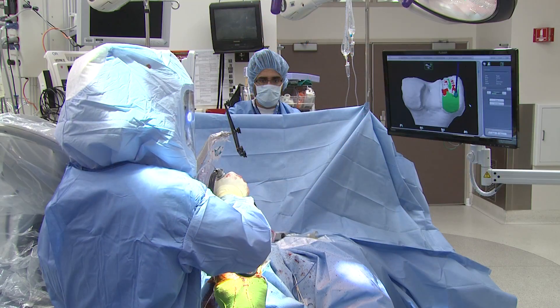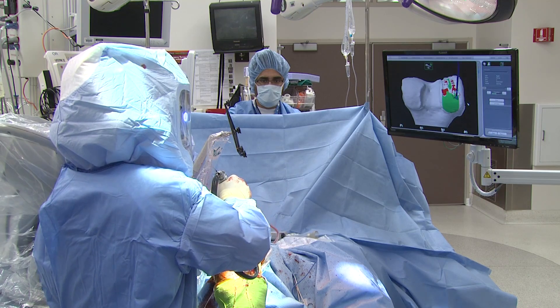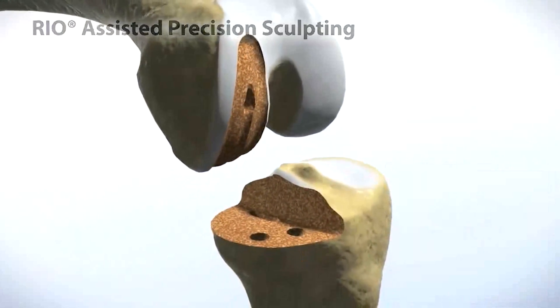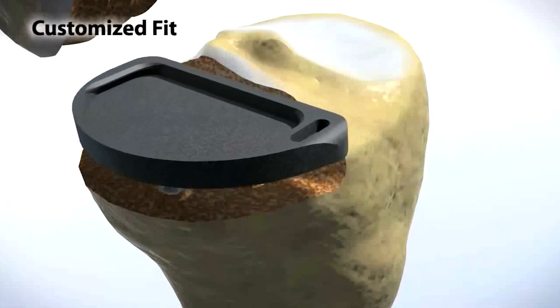The robotic burr — once we determine the ideal position of the implant — is a passive robot. So instead of a total knee replacement where we use a saw to cut the bones, in a Macoplasty we burr the bone. What the robot does, I say, is it doesn't let you color outside the lines. So as you prepare the bone, if you go too far to the right it stops, too far to the left it stops, too deep it stops. So you get perfect bone preparation.